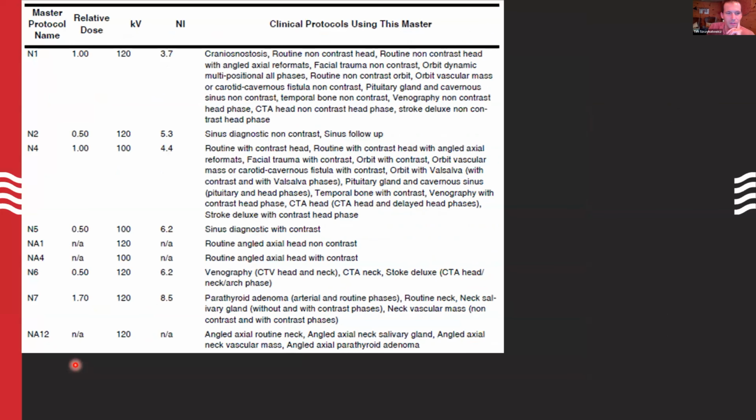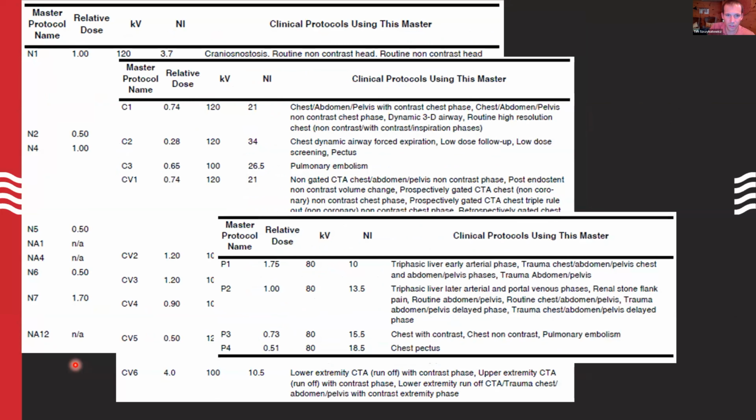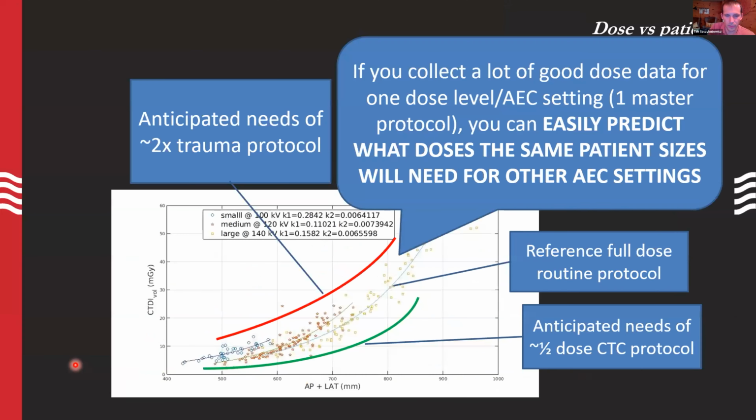Don't worry. All right, so we do the same concept for all body regions. I just showed you abdomen, or body, torso if you will. This is for neuro. We have the same thing. We do it in the cardiovascular section. We do it for our peds protocols.